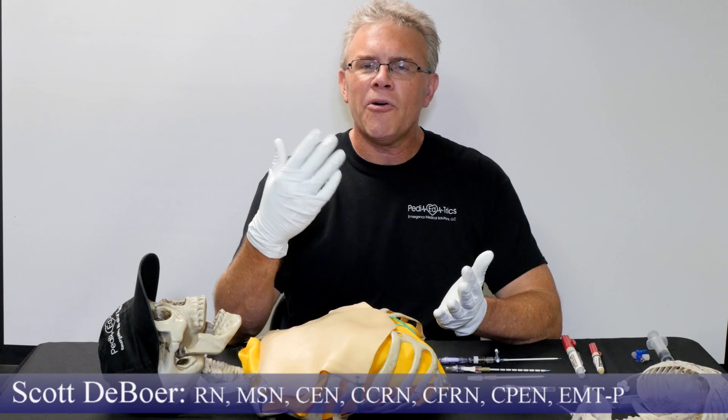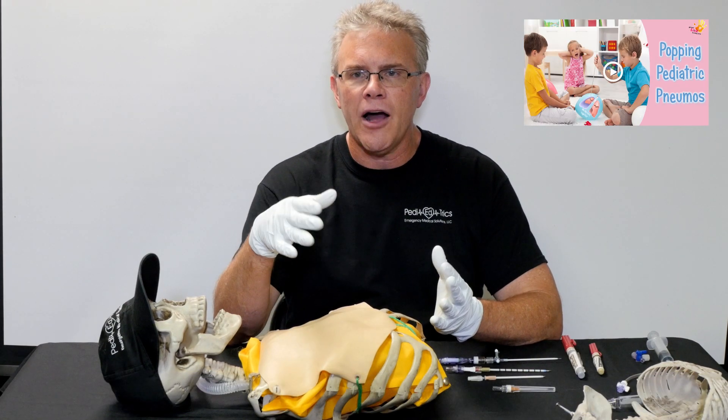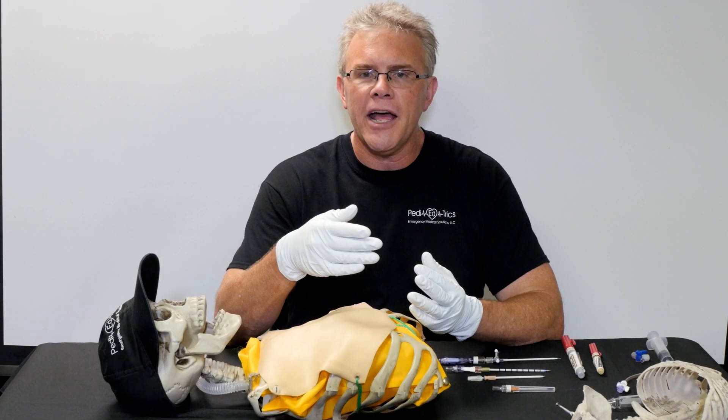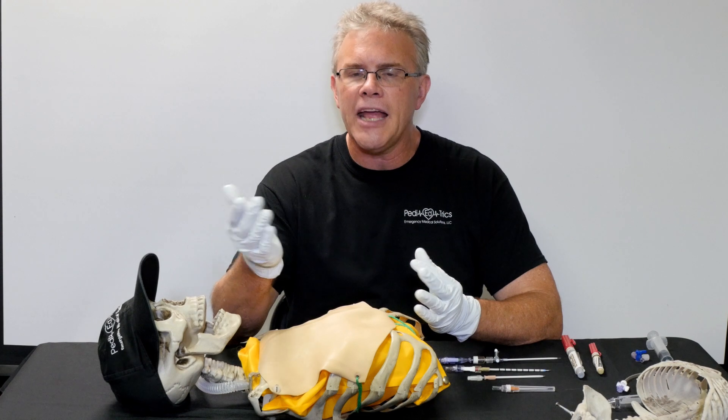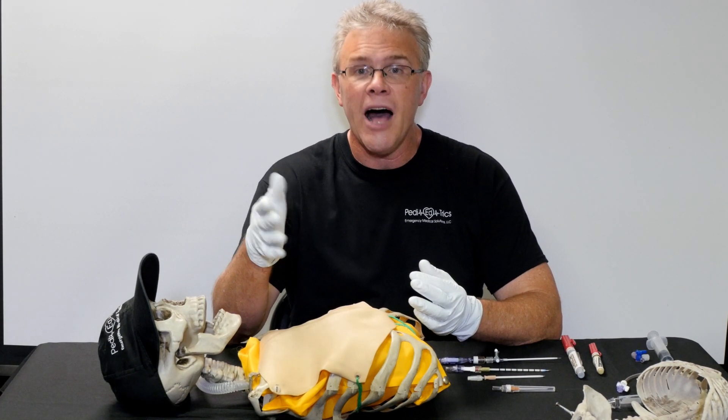Hey, it's Scott. In a previous Give Me Five, we touched on the whole idea of how to figure out where to needle a kid's chest. So now we're going to take that one step further and quickly address: now that you know where you want to needle, how do we actually needle?